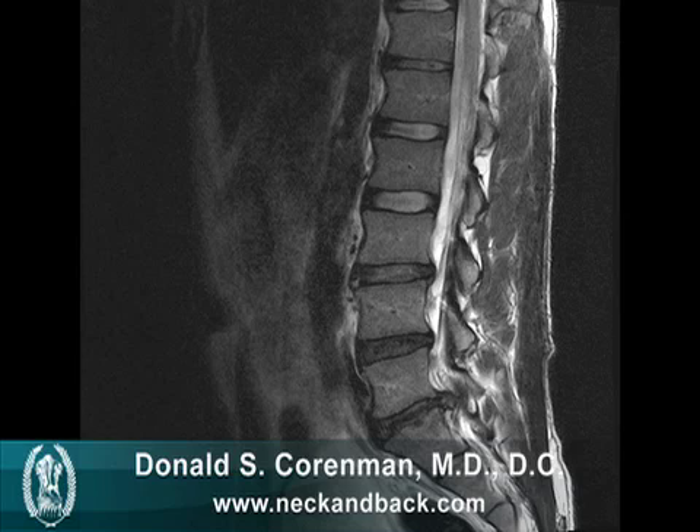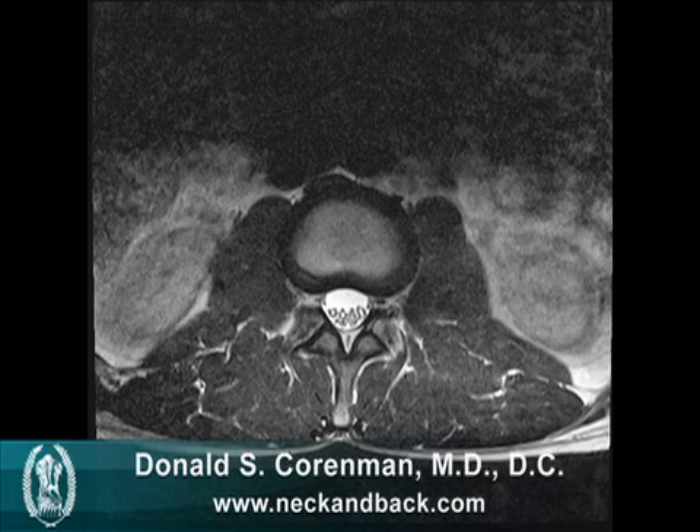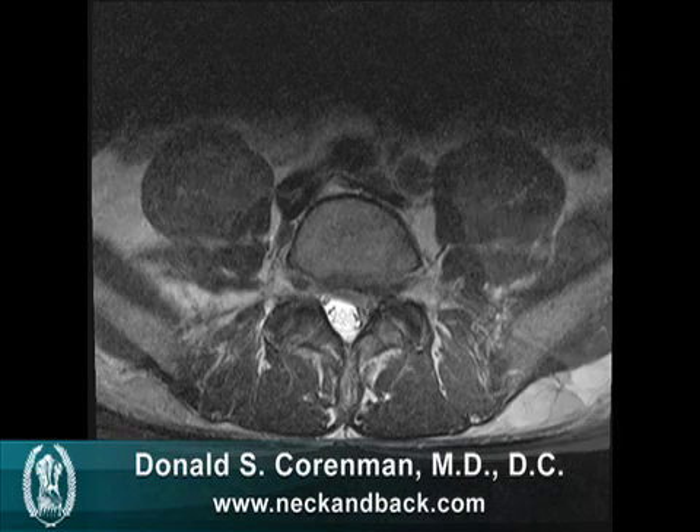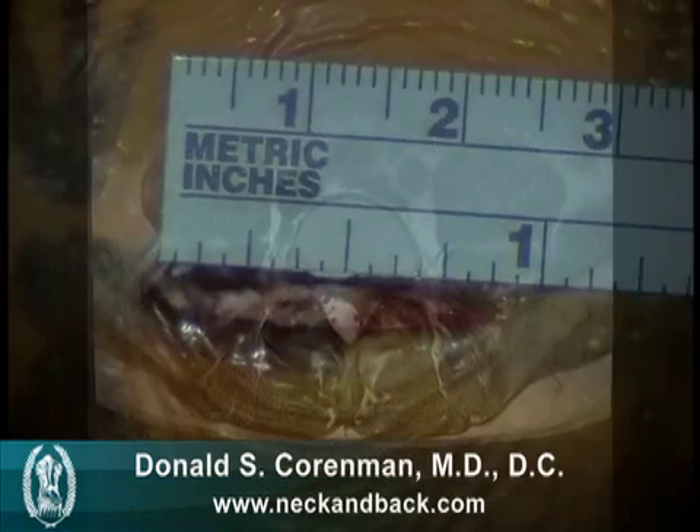Here's a side view of the MRI and you can see the disc herniation at the bottom level. This is a top-down view of a normal level, and then the next level has the herniation on that right side that's pressing on the nerve root, causing this patient significant leg pain.